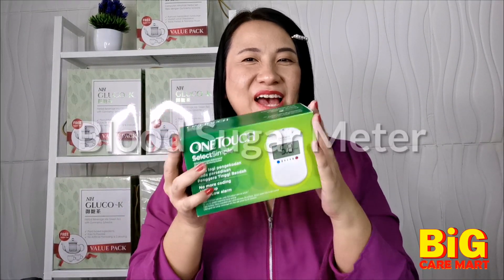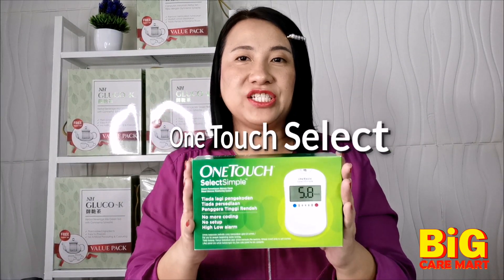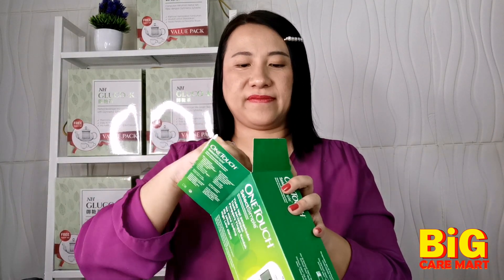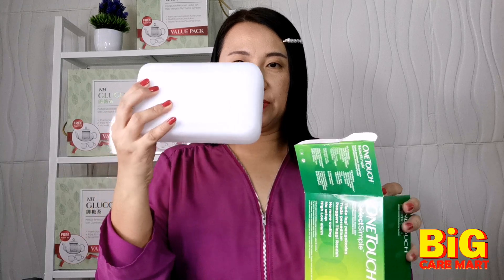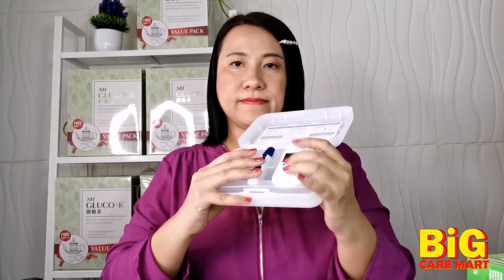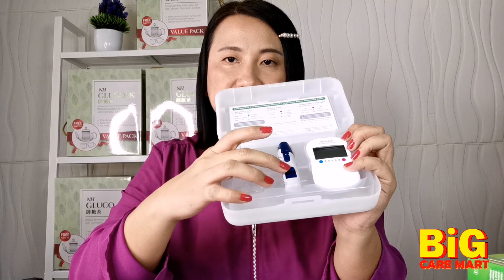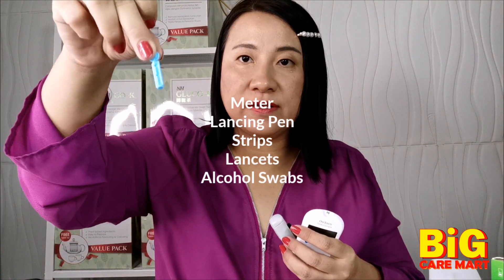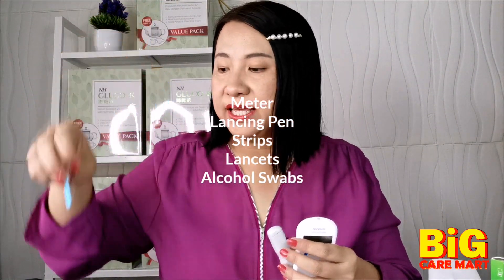Hi, I'm Kong from Big Care Mart, and today I'm going to demonstrate the One Touch Simple Select glucose meter. So inside the case, there's a meter only and a lancing pen. You have to get the meter, the lancing pen, and the lancets all separately — they are sold separately.